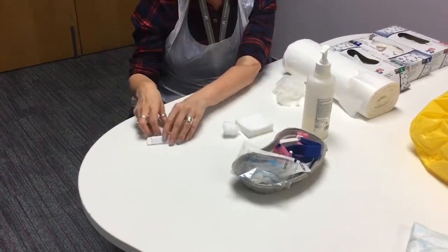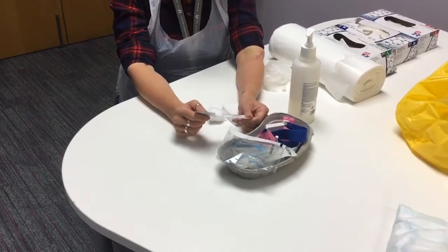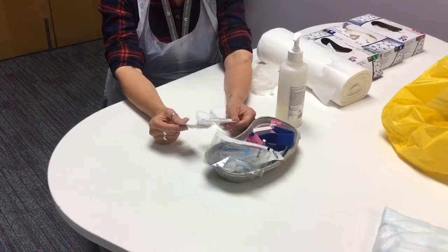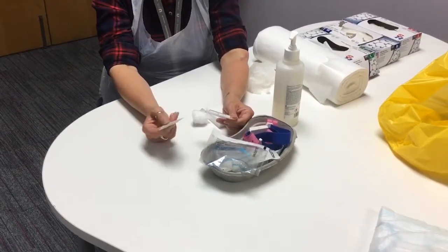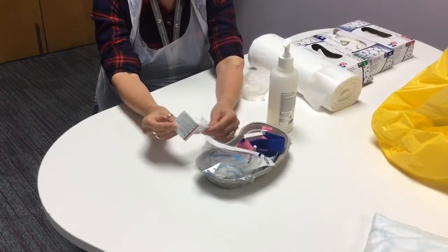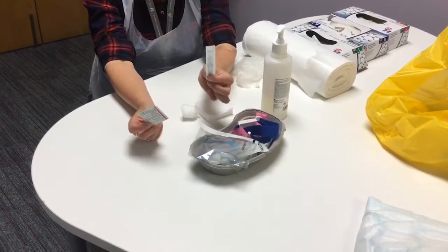You do need to clean the skin of your patient, but what's really important is to check hospital policy and procedure. Most procedures say that you've got to clean the skin and allow it to air dry. You can either use a sterret — again, check your expiry date — or chloroprep. I'll show you how to use both of those.